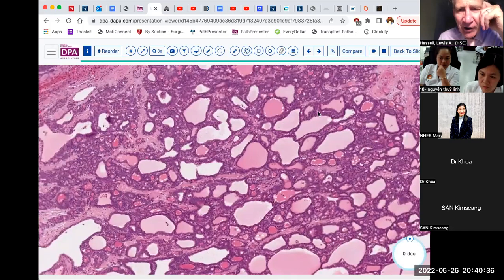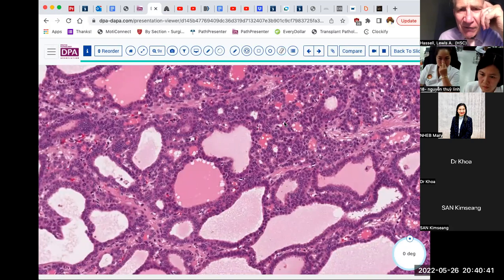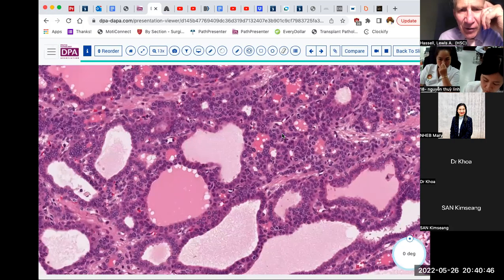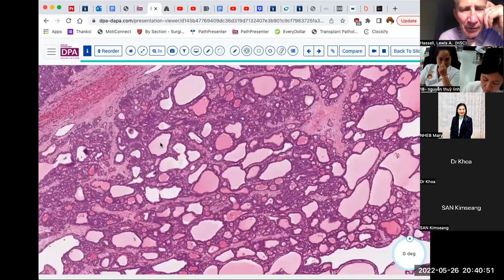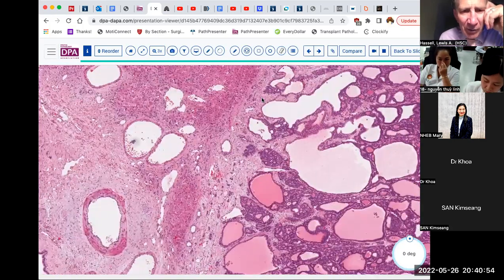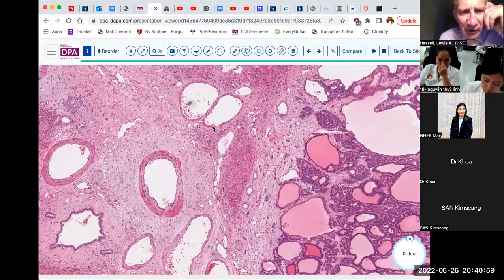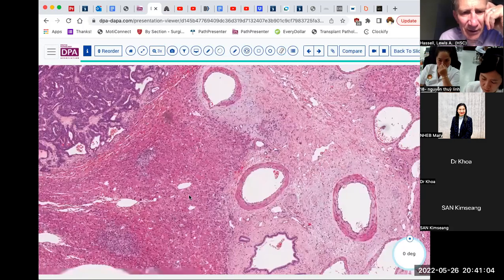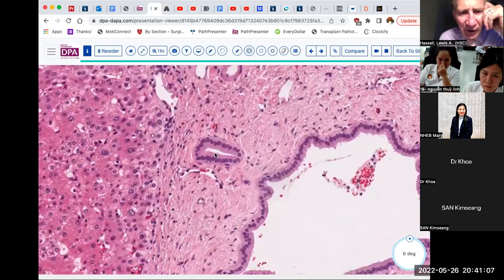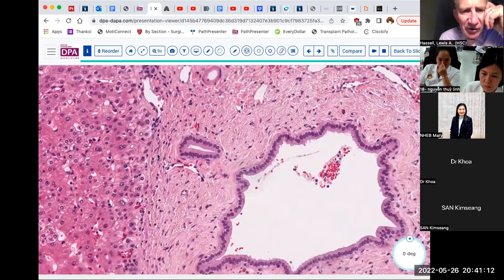Now, we call it cholangioblastic because it is more immature looking. Aside from making these follicle or glandular-like spaces, these are more primitive cells than the small cholangiolar epithelium, which we might see out here on the periphery. Let's find it for comparison. Okay, so here's some for comparison, with more pale cytoplasm, orientation, and so forth.